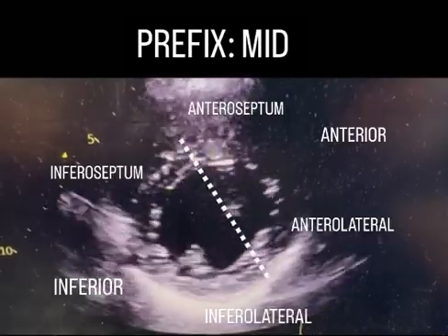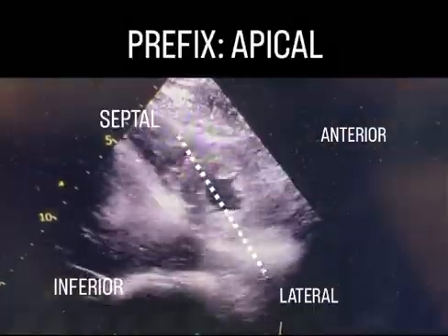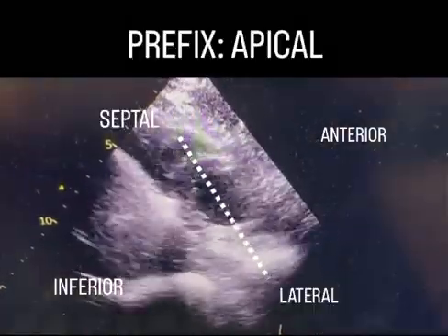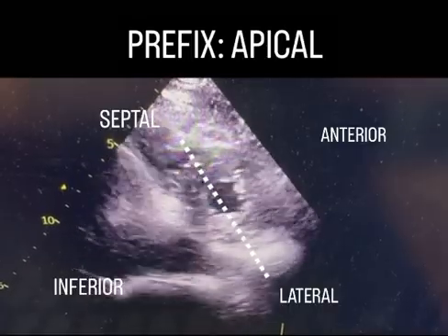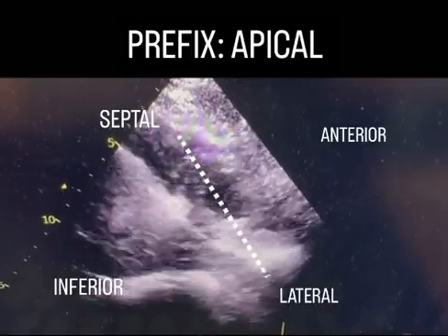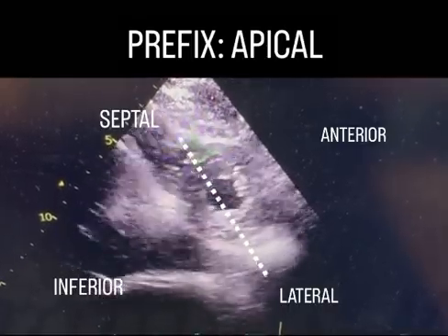We then move the probe down to the apex where we see the apical septum, the apical anterior, the apical lateral, and the apical inferior walls.